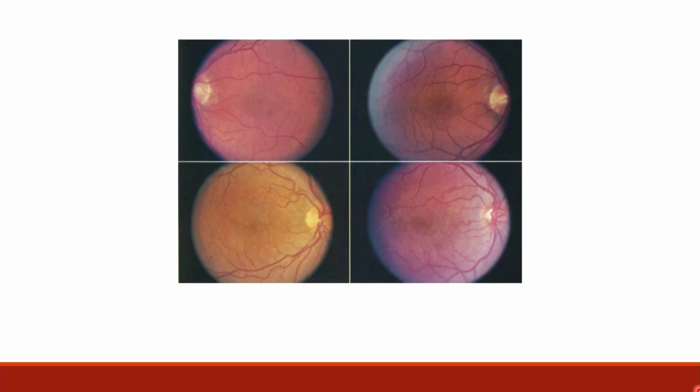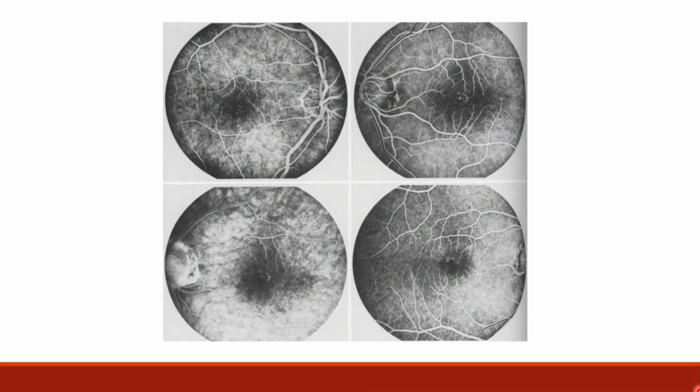The fundus photo of the various cases, case number 1, 2, 3 and 4 is shown, and they tried to show that the residual hyperpigmentary changes were seen even on follow-up, even if the vision had restored completely. These were the 4 different cases of this series. These were the case 1, 2 and 3 FFA shown, which showed transmitted hyperfluorescence, and staining was seen without any leakage.